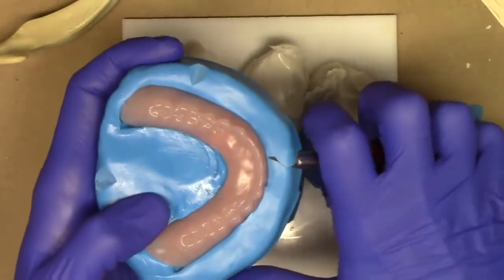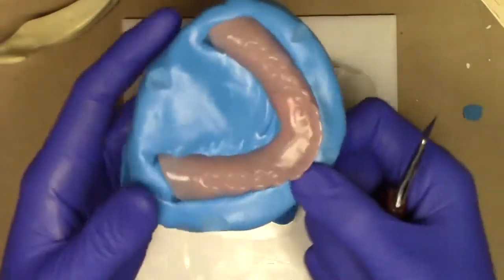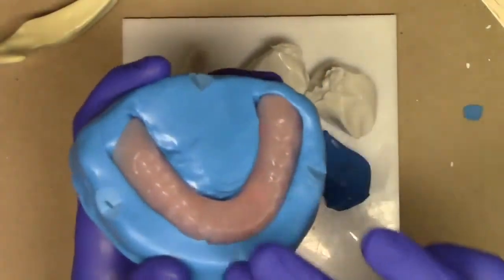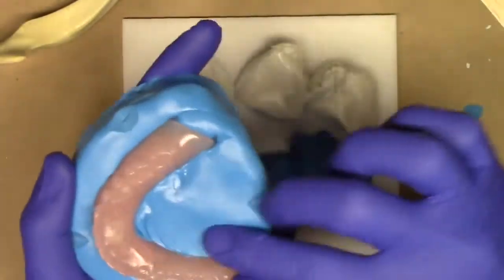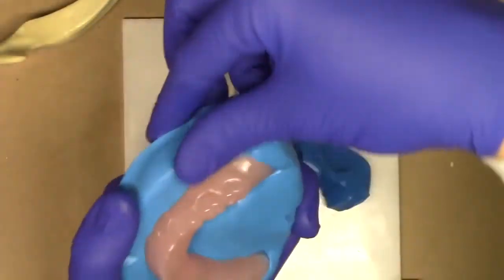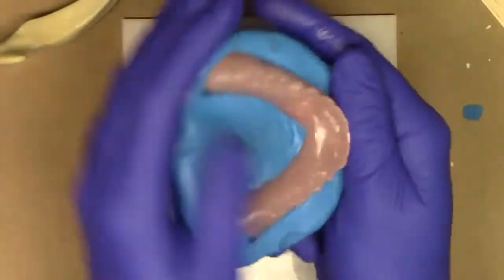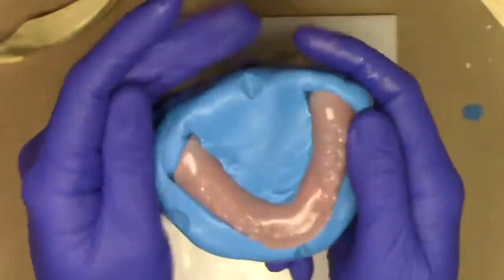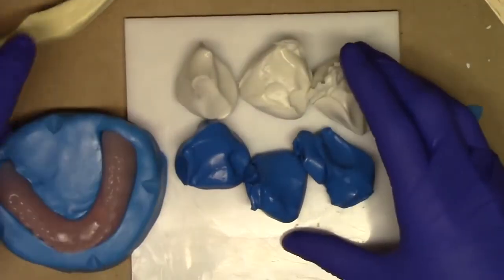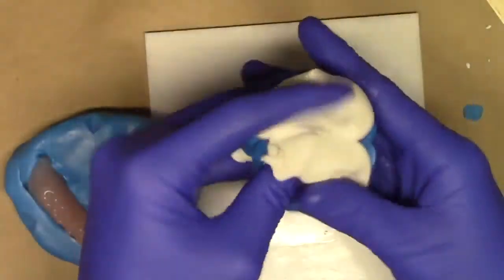I'll put a 4th one in just for good measure, just like so. Now at this point, you do want to coat petroleum jelly all over the putty as well, because if you're not careful and you don't put separator on this, the putty will bond to itself, just like so. Now we're ready to go ahead and take our additional putty and start combining them.